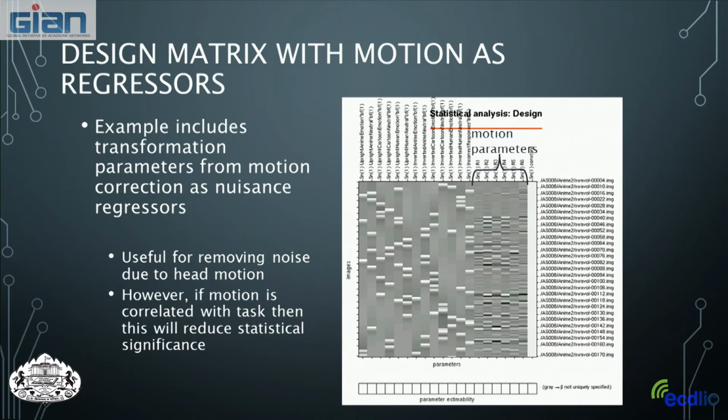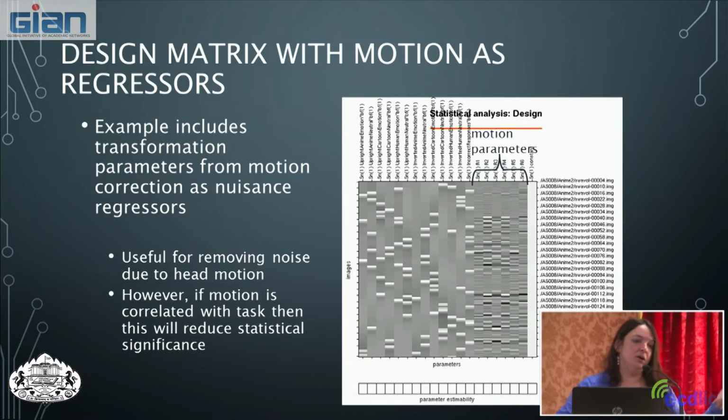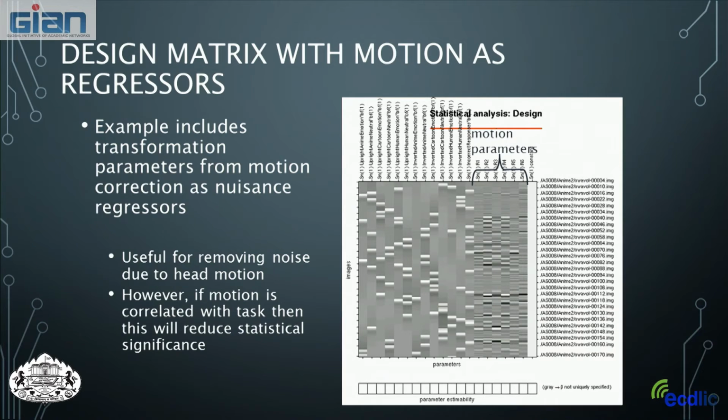You would see a squiggly line of how the person's moving, but you can also represent this in intensities rather than in numerical values. So they're still numerical values, but they're being displayed as intensities here so that we can see them in our model. So it's okay if you don't understand this completely. I just wanted to show you how SPM represents this, and we'll go through a very specific example next. So that might help you when you see that as well, and looking at actual conditions of the task.